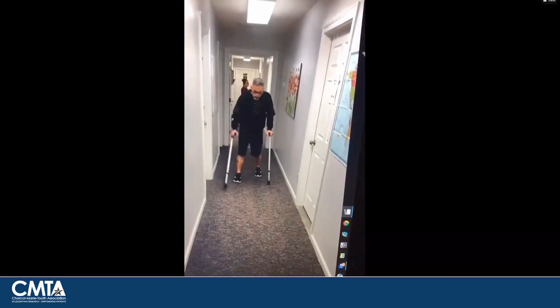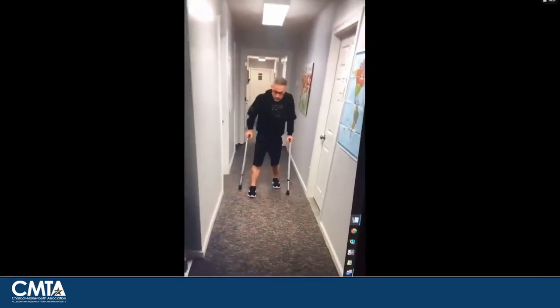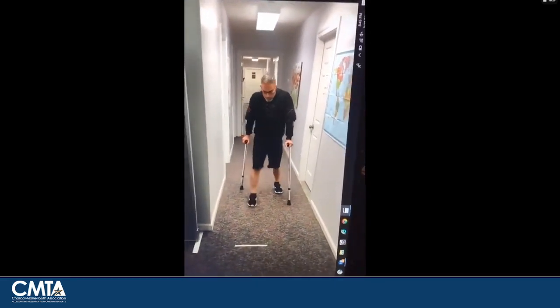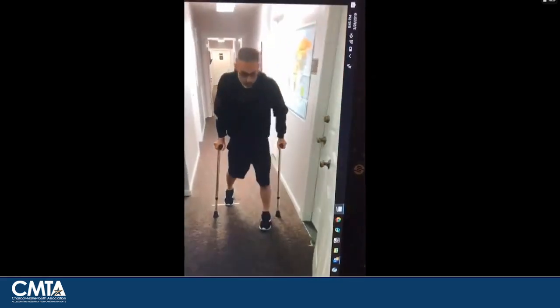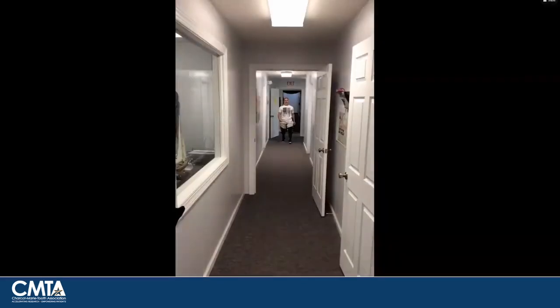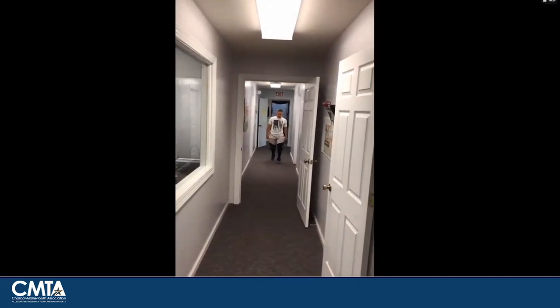This is also a gentleman who was injured in, I believe, Afghanistan, possibly Iraq. This was his gait pattern when he presented to clinic, right? He had spent basically 7 years in a wheelchair, really wasn't able to get around very well at all. So this required too much energy to walk, right? So here he is the day that he got fit with his C-braces.